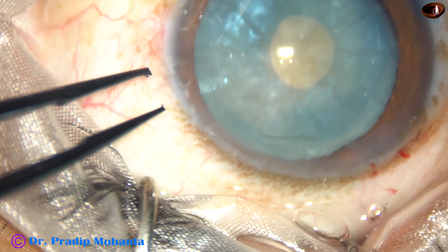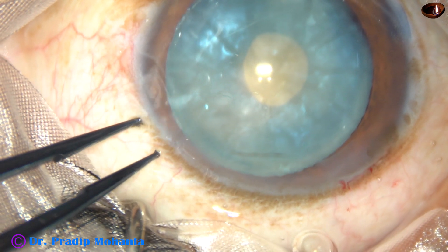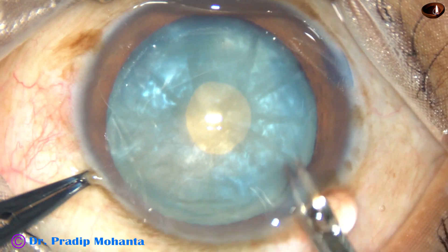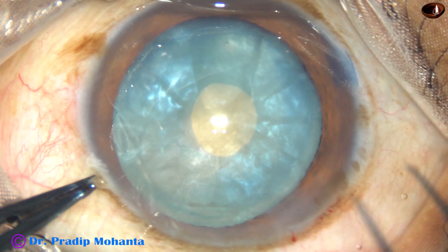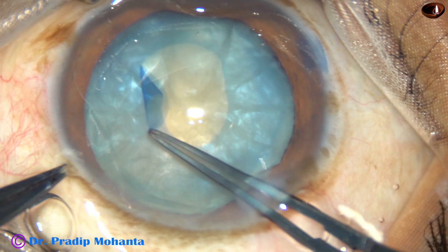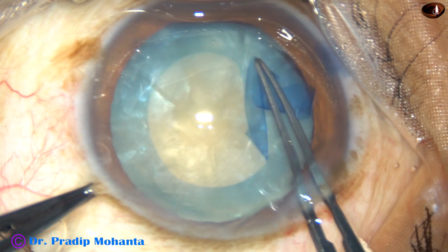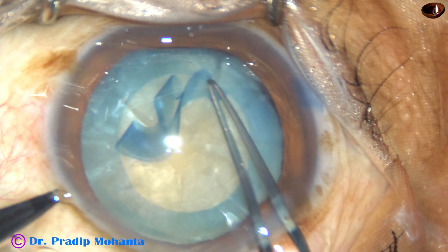Now, VISCO has been injected into the anterior chamber. You can see the patient is under topical anesthesia. I fix the eyeball with the tooth forceps, use a Vannas scissor and make a cut at around 8 o'clock. This is not a radial cut — this is an oblique cut. And now I use the forceps again, go all around, and do an optimum-sized round rhexis.